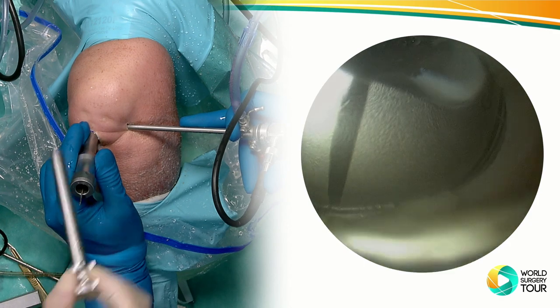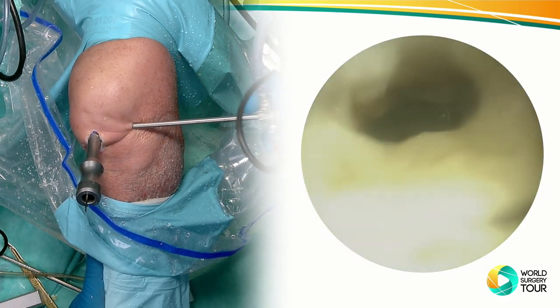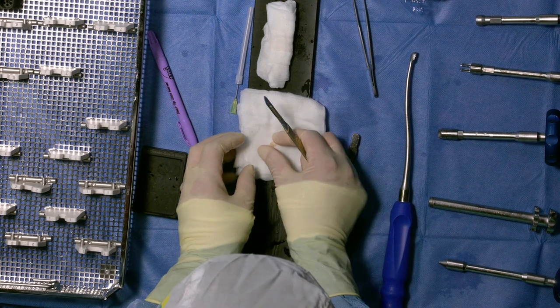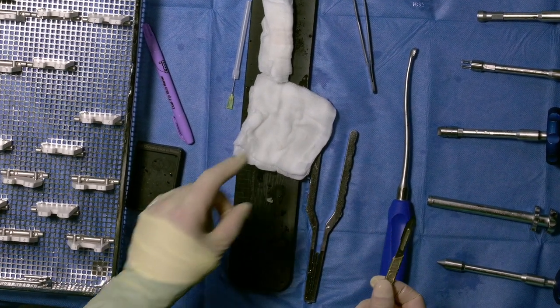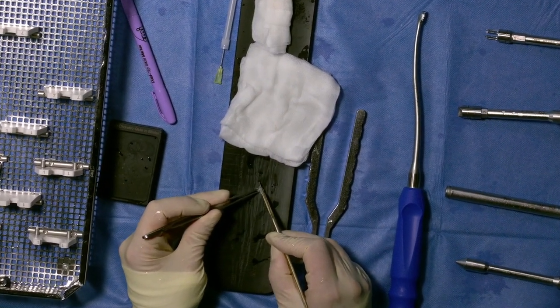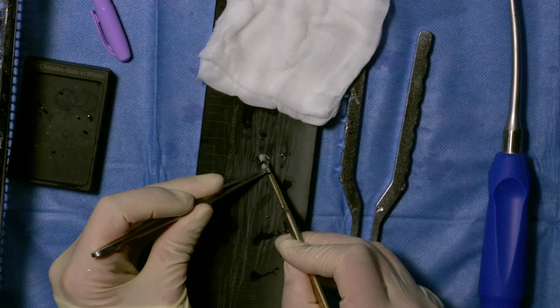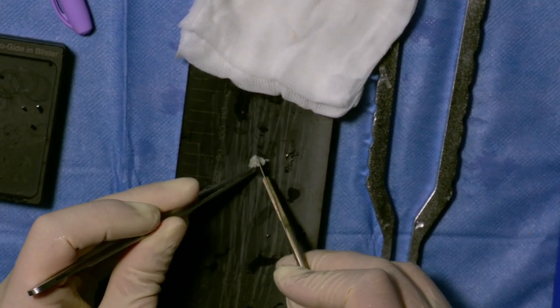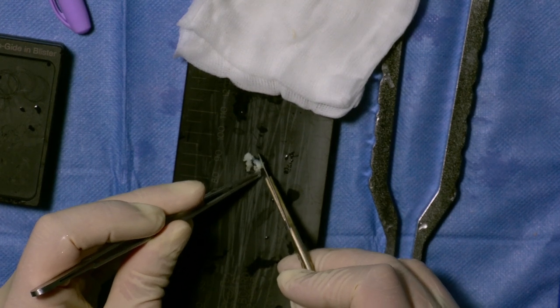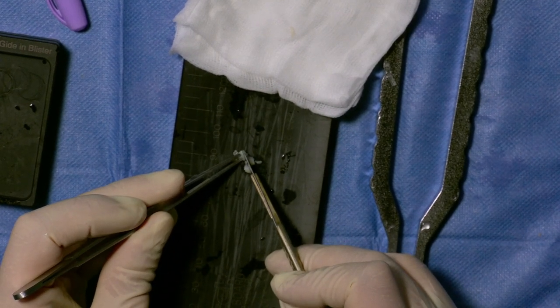Okay, so now, while this is in place, we're going to start working on the membrane. Okay, perfect. So, now it's important, we have two steps here on the side table. First, we used to prepare the cartilage a little bit, and since it should be minced cartilage, give me an anatomic forceps, please. It's important to cut the cartilage into tiny pieces to make sure that it easily fits underneath the membrane. And the membrane then should cover the cartilage pieces pretty well. So what we will do is put some cartilage pieces on the membrane and then one drop of fibrin glue on top of it and then use the membrane inserter to insert the whole complex into the defect.